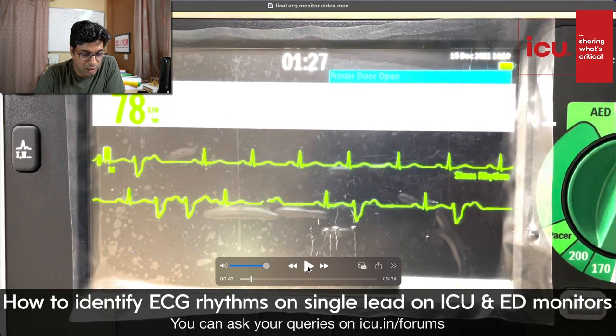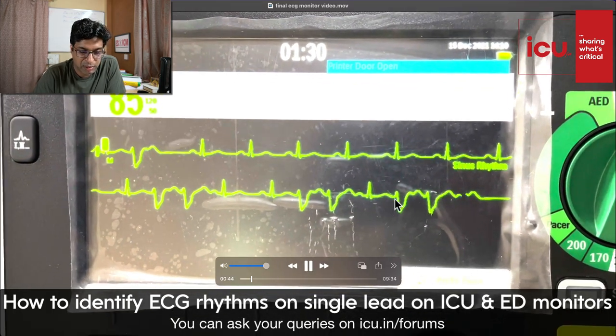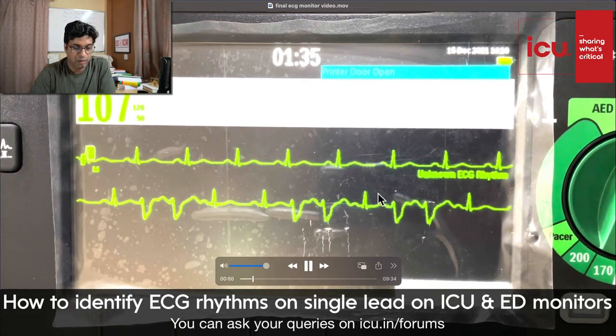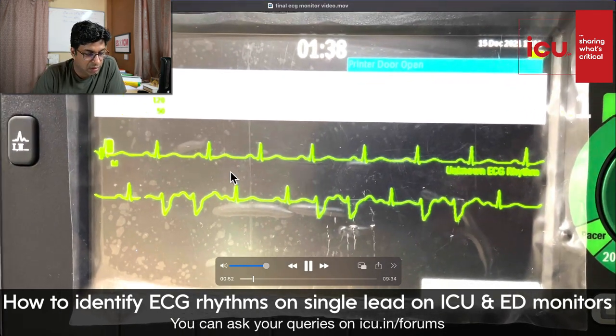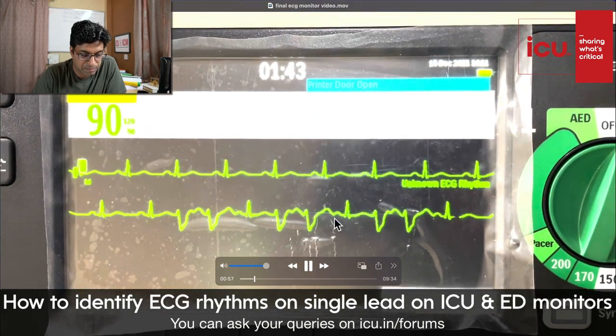Now, okay. So now they have started coming in pairs. Usually we call it bigeminy or couplets, and both are originating from the ventricle. So it could be bigeminy or couplets, but they are also premature ventricular complexes. See, they are coming in pairs. This is sinus, and in between the sinus, these PVCs are coming, couplets are coming. Okay, fine.